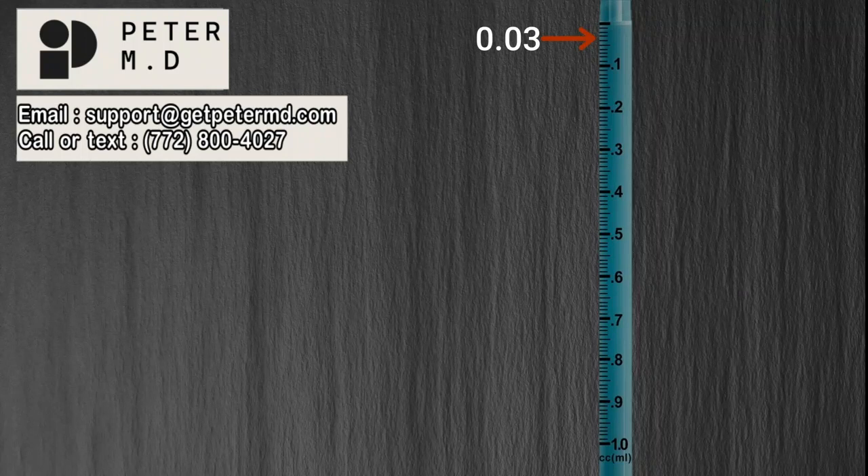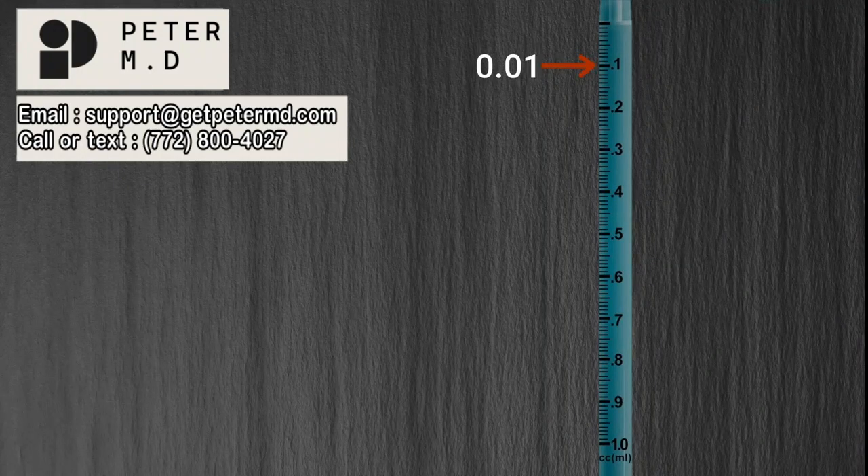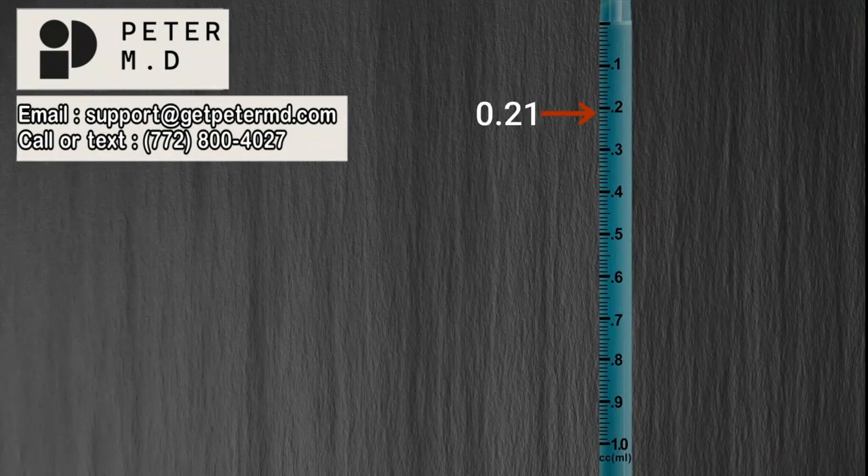Let's jump ahead so you can get a better idea of how the marks increase throughout the syringe. Here is 0.09, here is 0.1 — or 0.10 — because after 0.10 is 0.11, 0.12, and so on. So what is the value of this line? If you stated 0.21, you are correct.